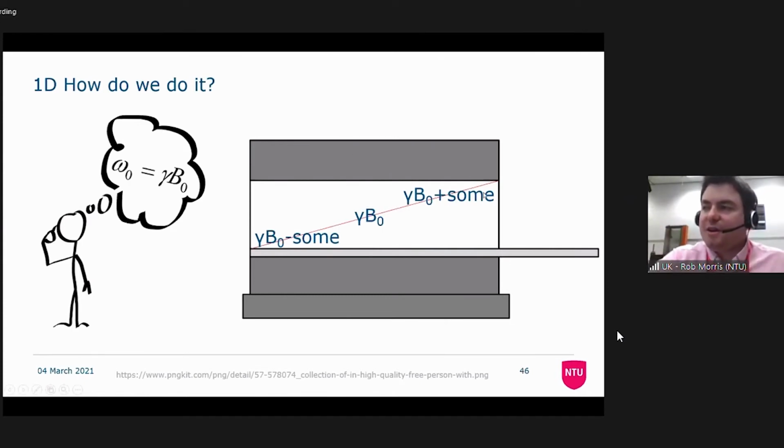Now this is one of the key concepts to MRI and making it work successfully. We have in space changed the value of our magnetic field. We've not changed the static magnetic field at all. It's always there, it's always B0. We've just added to and taken away from that field to give us a variation in the magnetic field which we're seeing inside.